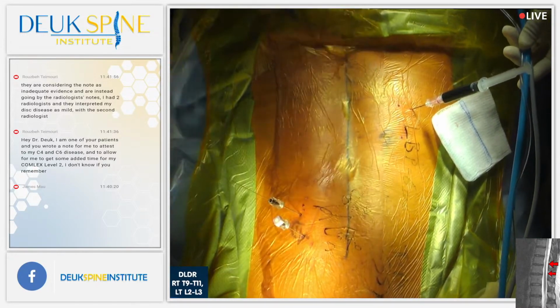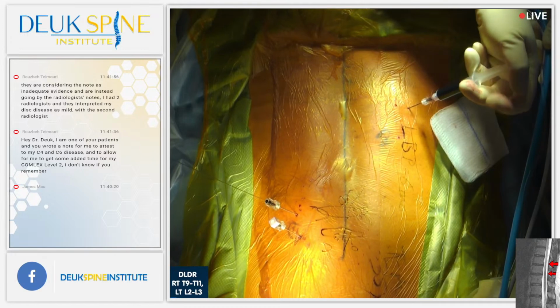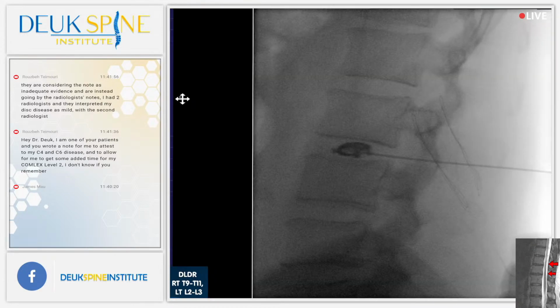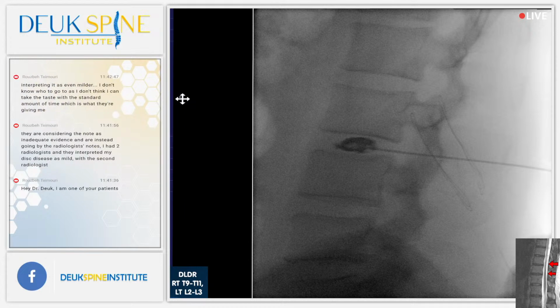I need your help for one more. How much pain is that causing? How much? On a scale of 1 to 10? 9.5. Is that where you get back pain? All right, you're going to go to sleep now. 9 1/2. All right, we'll do it for him. Concordant. That's L2-3. So L2-3 is a 9.5 concordant. T9-10 is a 9/10 concordant. And T10-11 is a 10/10 concordant. So we hit the bullseye, folks.